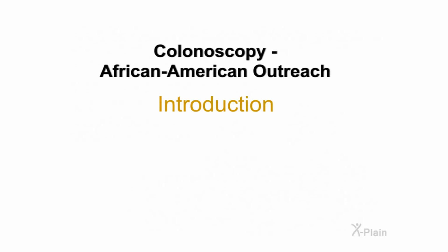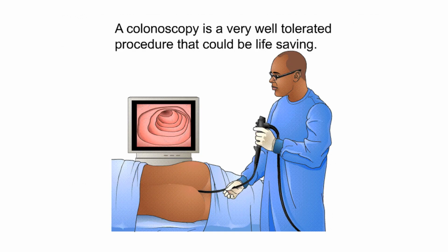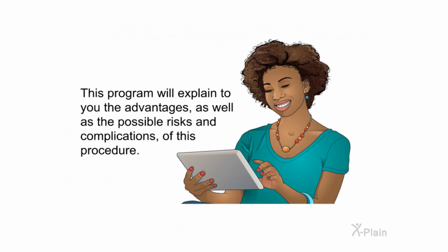Colonoscopy. African American Outreach. Introduction. A colonoscopy is a simple procedure that allows your healthcare provider to look inside the colon and to discover certain diseases, such as cancer, very early. A colonoscopy is a very well-tolerated procedure that could be life-saving. This program will explain to you the advantages as well as the possible risks and complications of this procedure.